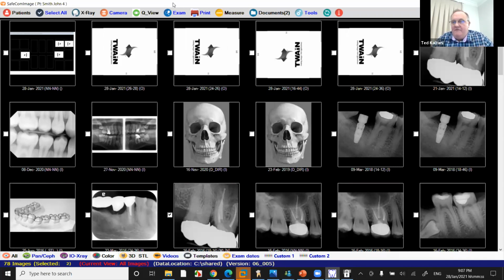Let's say you have a FMX18 you're doing on a ScanX from room 1. You go into the scanner, you start scanning from the 4 different slots. Somebody comes and needs an endo from room 1. Well, you're going to have to wait. You're going to have to wait 10, 12 minutes until I finish my FMX from room 2 before you can do that endo. It makes no sense at all. Because on the film processor, you were able to do 4 different patients at the same time. When ScanX came out, that feature was missed.